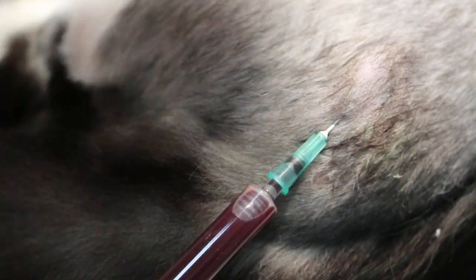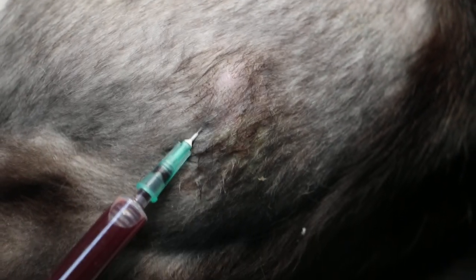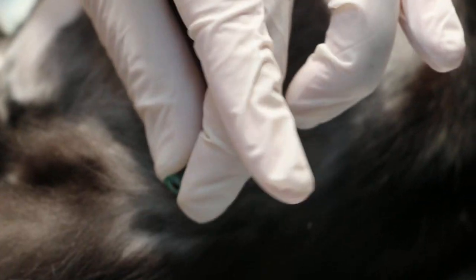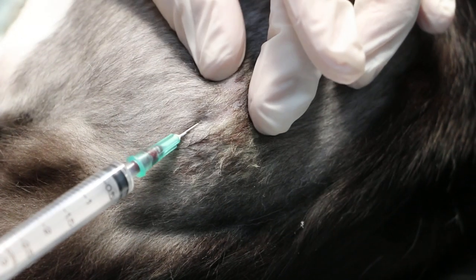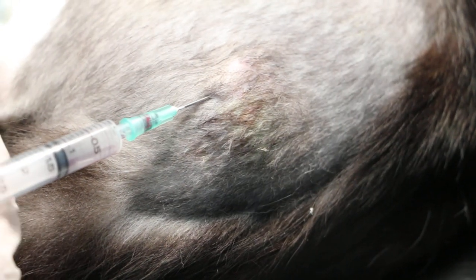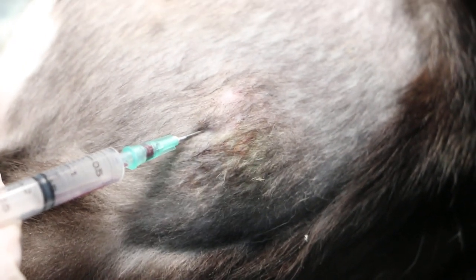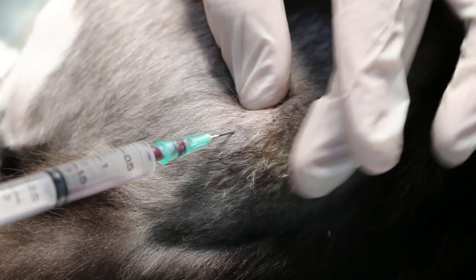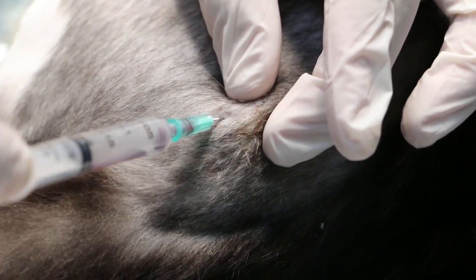I will have to take another syringe — hopefully there is no more after that. We will just try and aspirate as much as possible so that there will be no more swelling and no infection. Now you can see there is no more swelling here, though maybe it will swell again tomorrow. In this cat we don't really need to sedate — sometimes you do. The swelling is almost gone now.